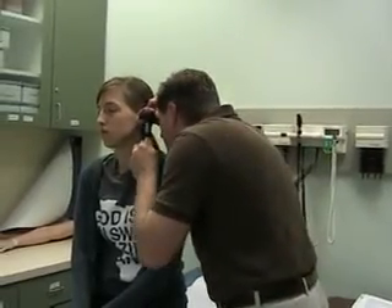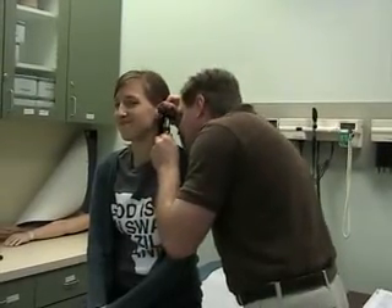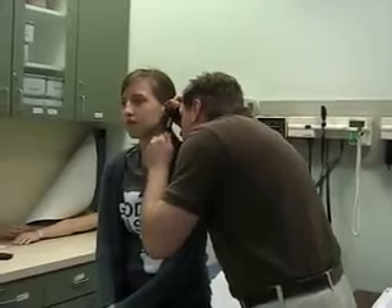First thing is inspect the ear. Next is check for tenderness — does that hurt? Then what we're going to do is look inside. So you pull up and back, and then you put the otoscope inside. Aim a little bit forward and you should be able to see their tympanic membrane.